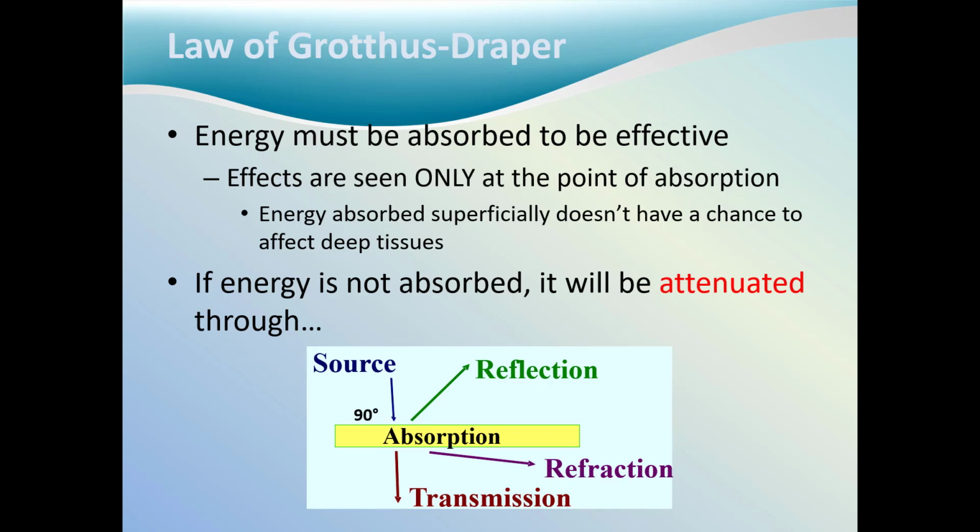Absorption occurs when the tissue collects the wave's energy and changes that energy into kinetic energy and then possibly into heat. The tissues may absorb part or all of the energy being delivered to the tissues. Any energy that is not reflected or absorbed by one of the tissue layers continues to pass through the next tissue until it strikes another density layer. At this point, it may again be reflected, refracted, absorbed, or passed on to the next layer. Each time, the wave is partially reflected, refracted, or absorbed, reducing the amount of energy available to deeper tissues.